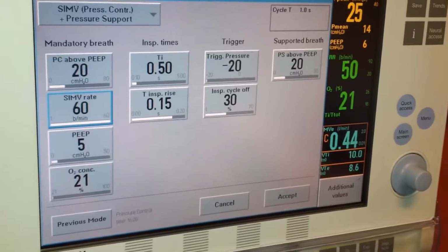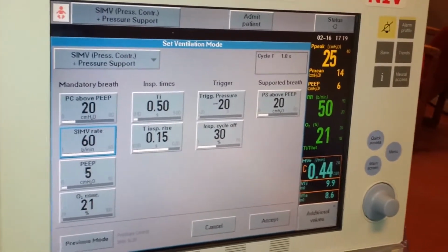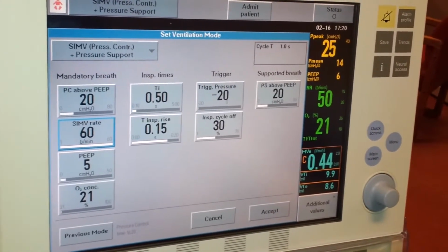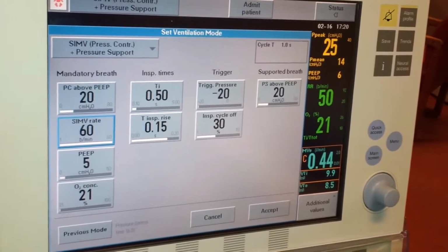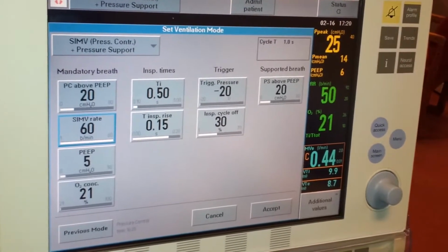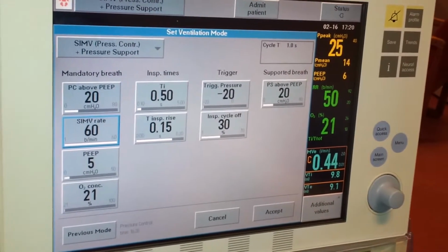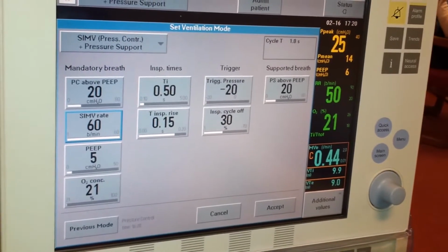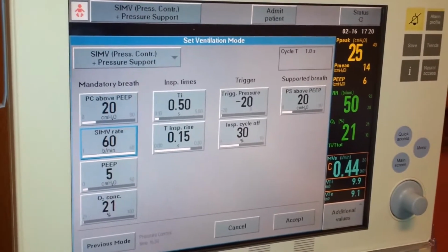So you'll be expected to know two basic ventilation strategies for obstructive and restrictive patients, and be able to adjust your settings for specific pathologies. The most common type of restriction seen in neonatal populations is respiratory distress syndrome, or RDS type 1, and prematurity in general. The more premature, the more restrictive the baby will be. With these types of patients, you will use a strategy that includes lower tidal volumes and increased respiratory rate.